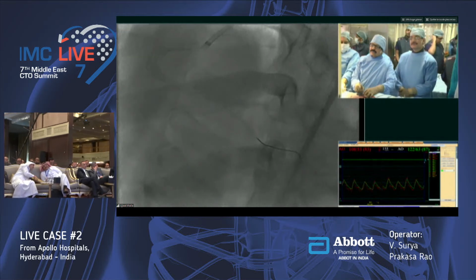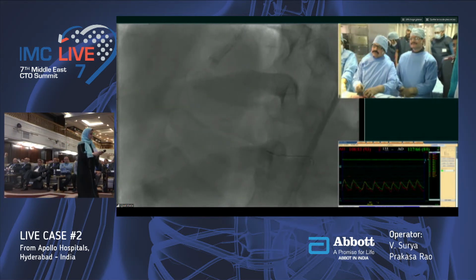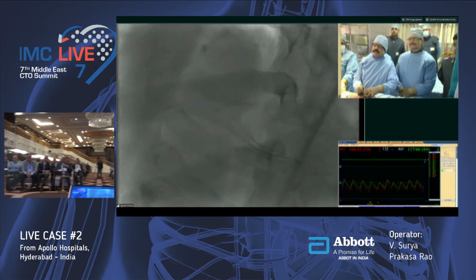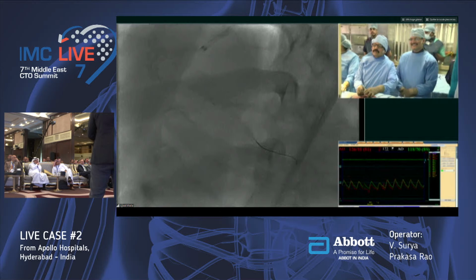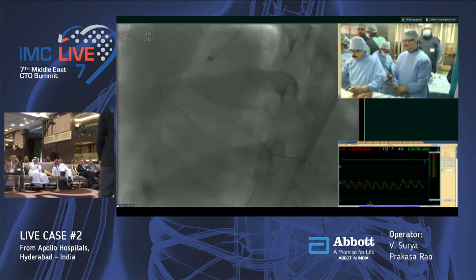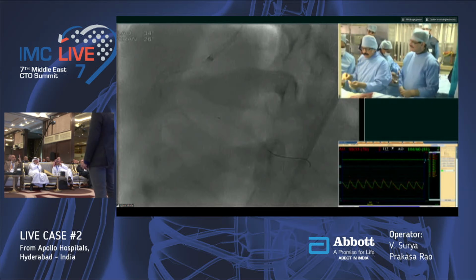So we will go for a soft wire for a PLV? Why a stiff wire for crossing a side branch? Nobody would do that. So I don't need an intermediate stiff wire. Do you think he will succeed to cross? Yes, hopefully we'll do that. Yeah, I think he will succeed? A few, huh? So you are not optimistic?